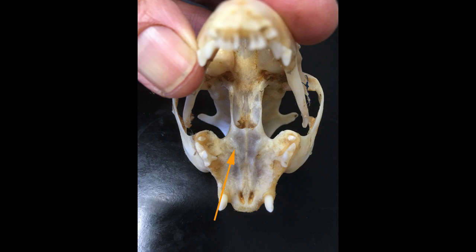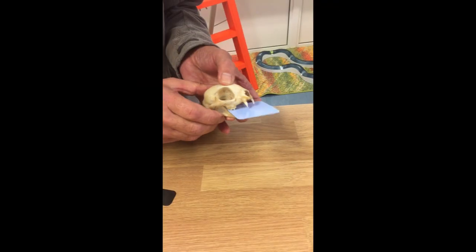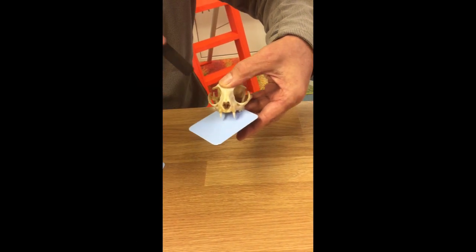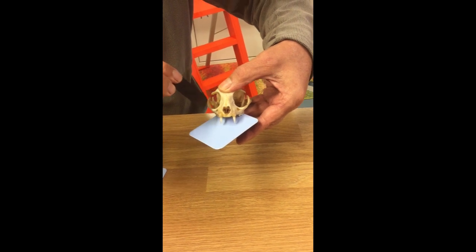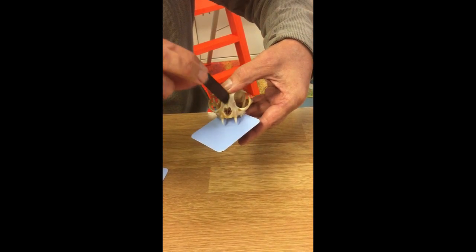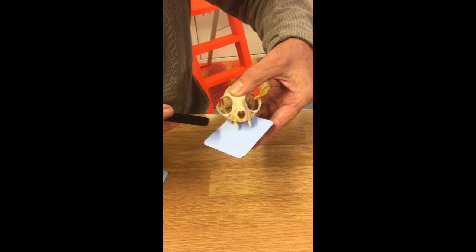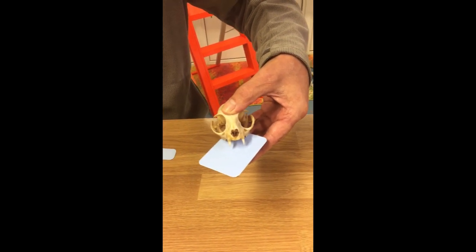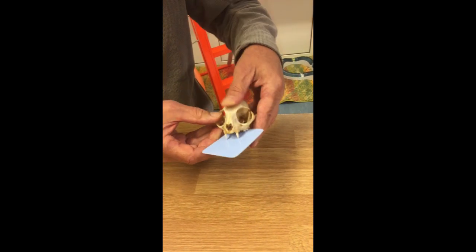So we'll now do the same thing with the upper carnassials. With a dog, all we would do then is just come in at 45 degrees there, so the shadow of our cheek teeth would give us the image on the plate. Unfortunately in the cat we've got this orbital rim there which messes things up, so we then need a different technique.